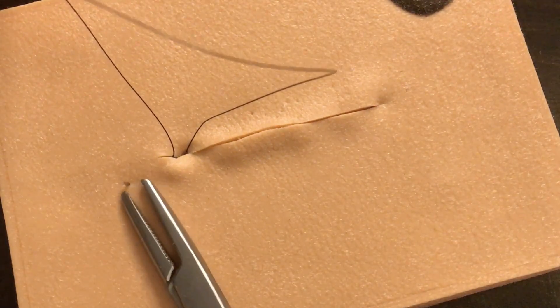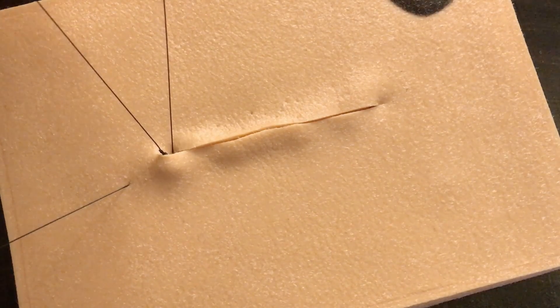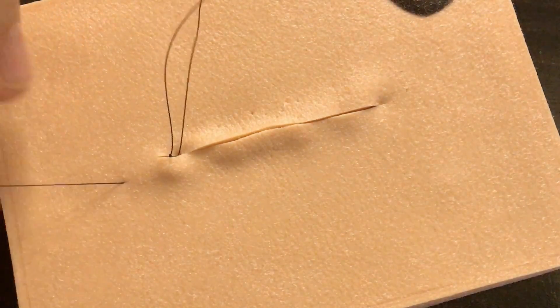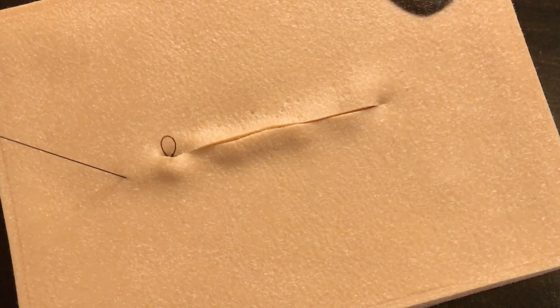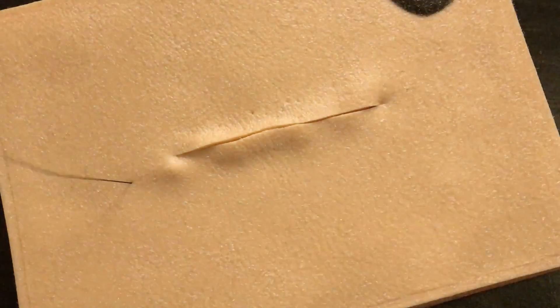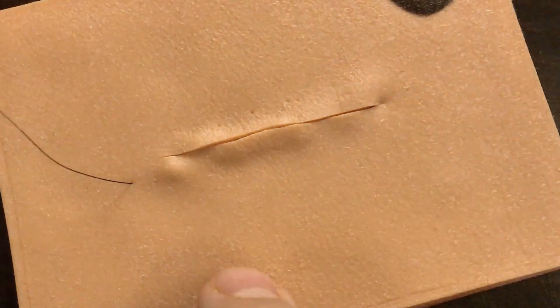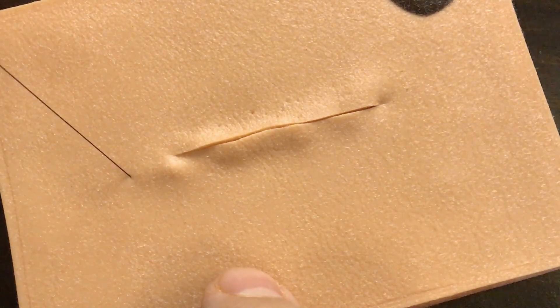Out here in the skin, open skin, and I'm going to pull that through. Now watch what the knot does. See the knot there? Keep an eye on the knot as I pull this through. It's going to flip that knot upside down. The knot disappeared. It is no longer anywhere to be seen. It is in the depths of this incision because that way we just flipped it upside down. We buried the knot.